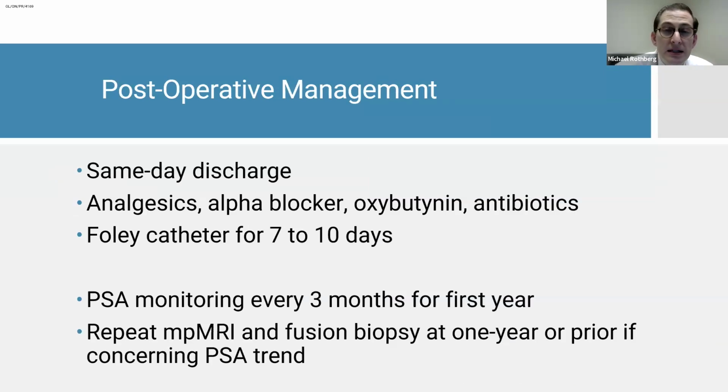I do insist on these patients returning to have their catheters removed for voiding trial on a day when I'm present in clinic, just because if for some reason they're unable to pass that voiding trial and they need to have a catheter replaced, I want to be aware of it, and potentially I might want to be the one to replace the catheter myself.